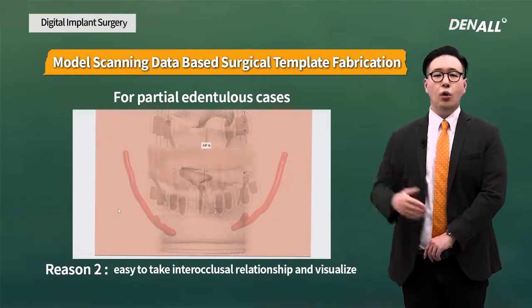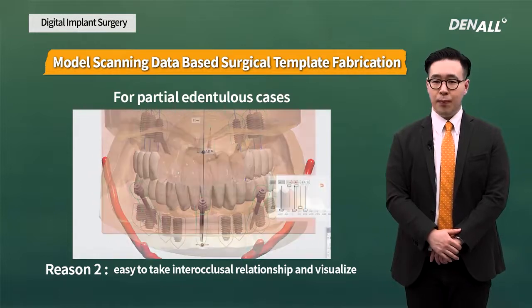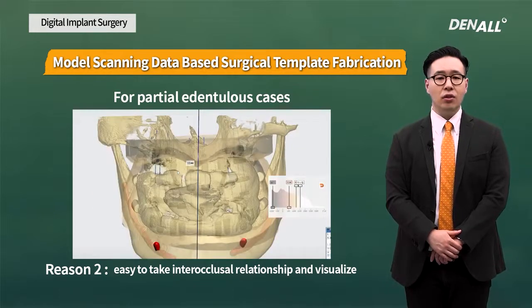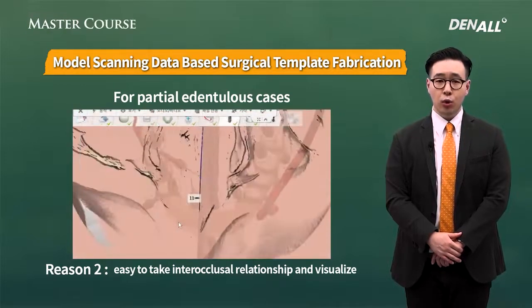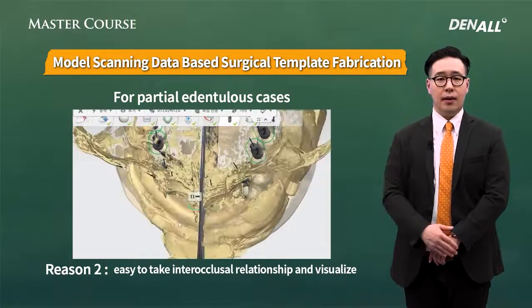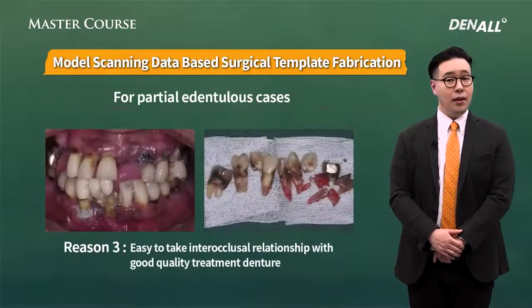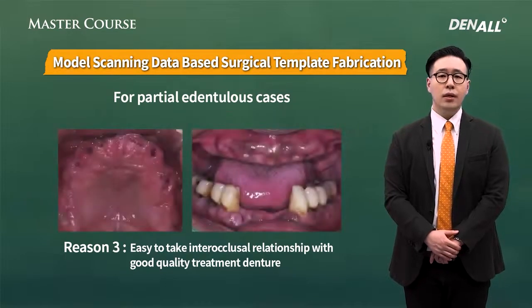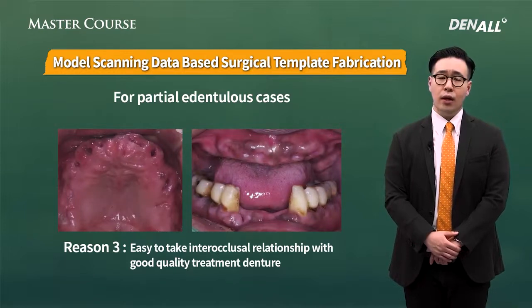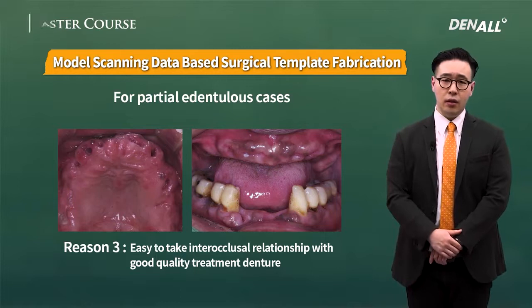In the video, the patient's anatomic structure, for example, by referencing the nasal septum or nasal spine on the stable interjaw relation, midline and temporary prosthesis are positioned. If after extracting hopeless teeth, we have to wait a certain period of time until healing, for function and social activity, a treatment denture may have to be used.